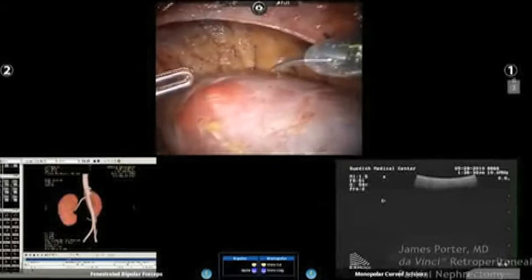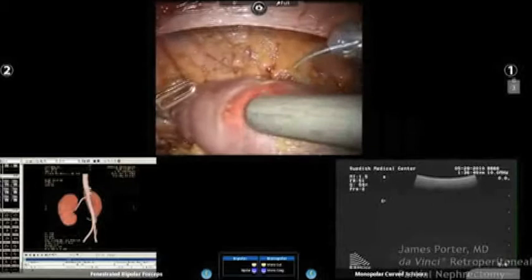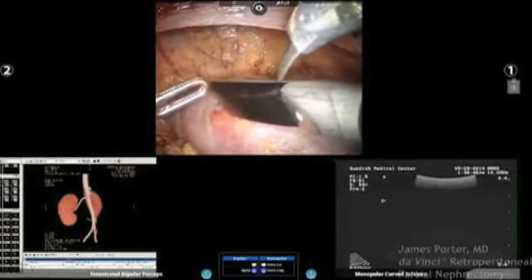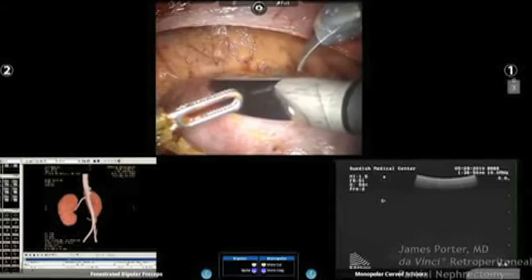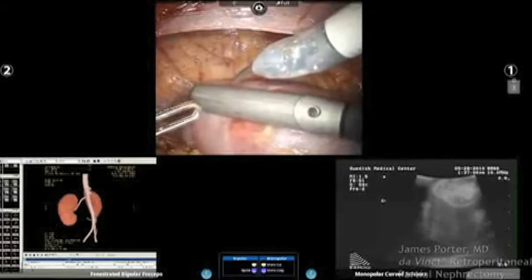And then I'm going to show you on the ultrasound probe what we use as landmarks to help guide our removal here, because this is a deep tumor. My feeling on these endophytic tumors is you need to go deep and wide. So Nance, rotate it towards them so they can see the black part. You see these black marks here? This represents the edge of the ultrasound view. So one there, and then one on the very end. We're going to use those to help guide the marks that we place for our margin of resection. Okay, Nance, so let's go cephalad caudad first.